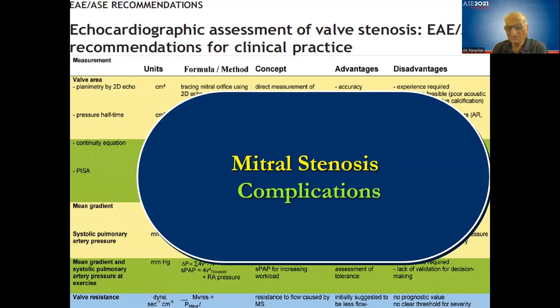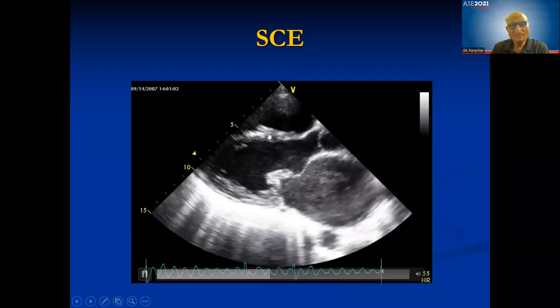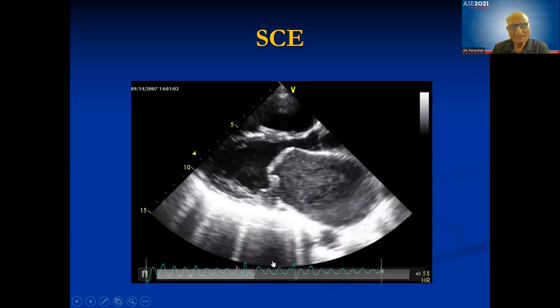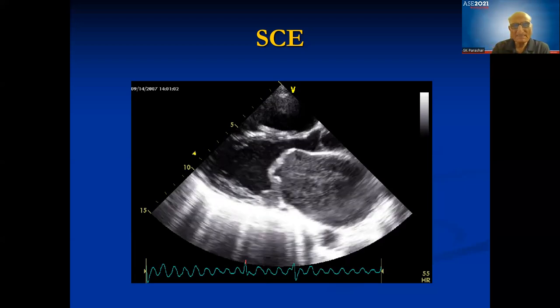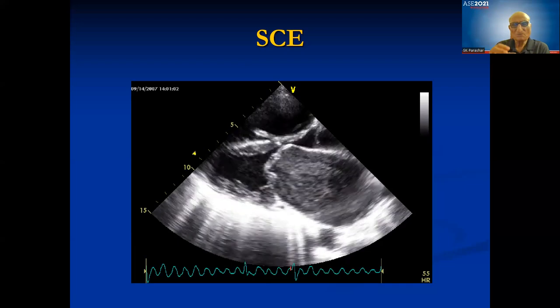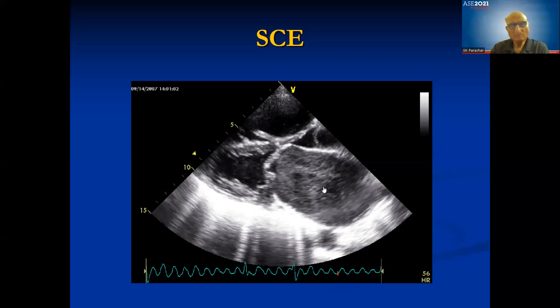A common finding is spontaneous contrast echo — seen in atrial fibrillation or low flow states. The ultrasound beam causes a dense smoke-like appearance in the left atrium. This is due to very low flow, especially in atrial fibrillation, where the ultrasound beam produces spontaneous contrast echo.